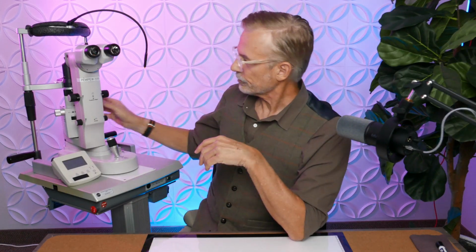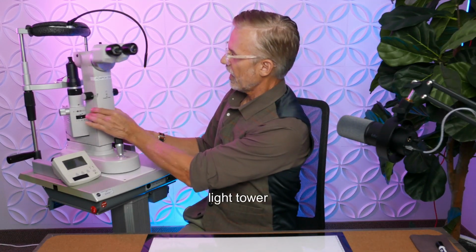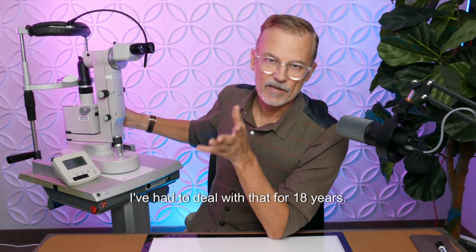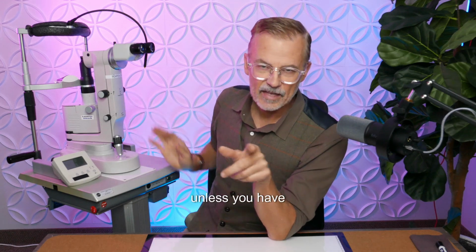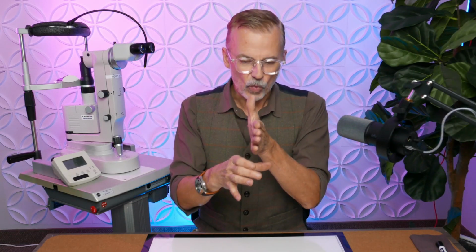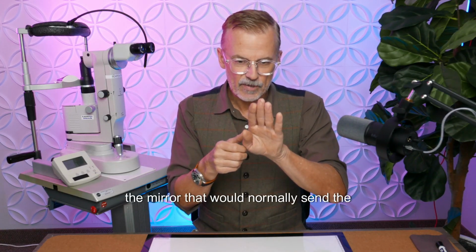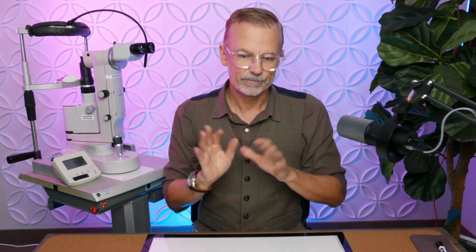One of the big challenges, and I'll discuss it more when I get over to the lasers there, is that this light tower will block the energy right down the center. I've had to deal with that for 18 years. So you always have to have the light source off to one side or the other, unless you have the LX Ultra Q reflex model, which allows the light source right down the middle, coaxial with your view. When you fire the laser burst, the mirror that would normally send the light to the back of the eye drops down briefly and pops back up again. There are some problems with that I'll discuss later.